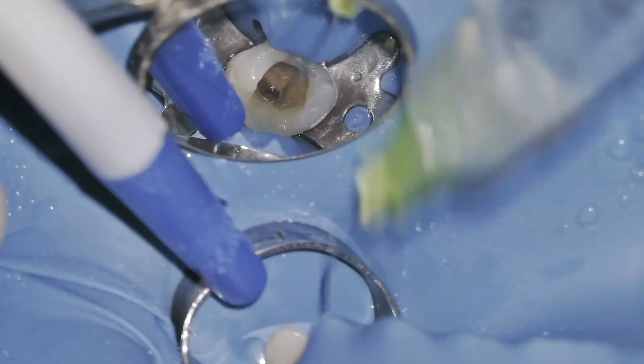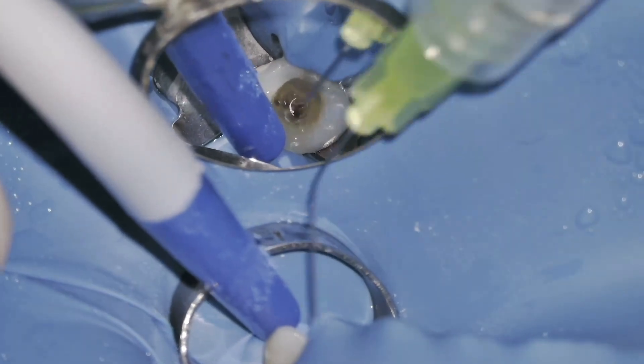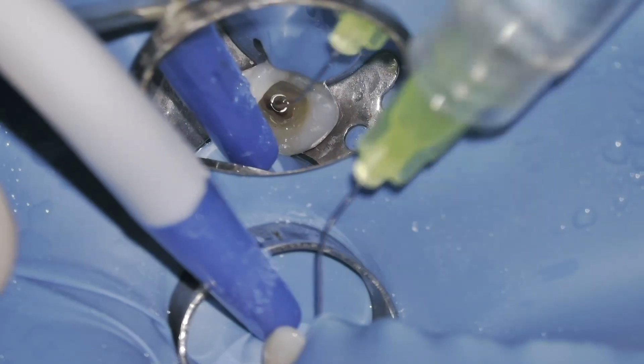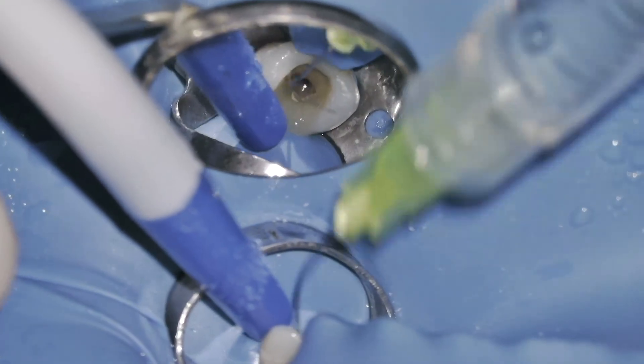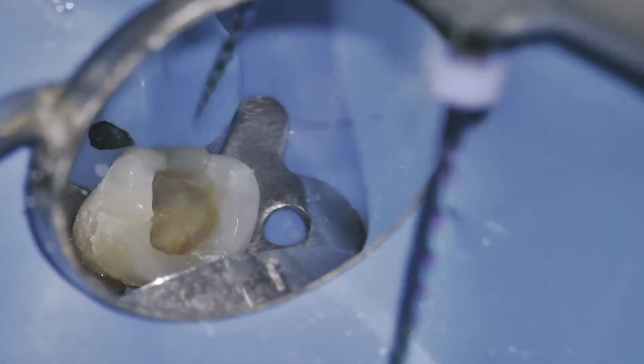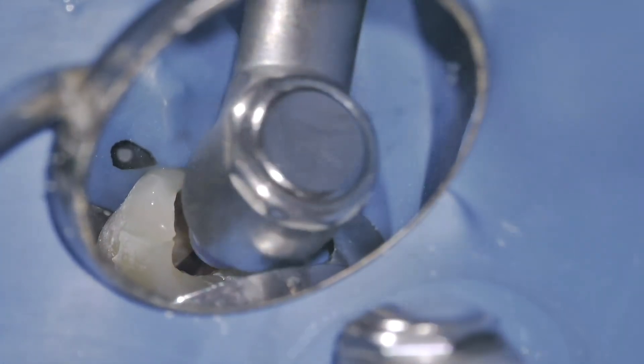Before beginning the root canal treatment, I usually perform pre-endodontic restorations to seal any coronal defects or access points left by the previous interventions. Once canal access is achieved, I move on to cleaning and shaping.